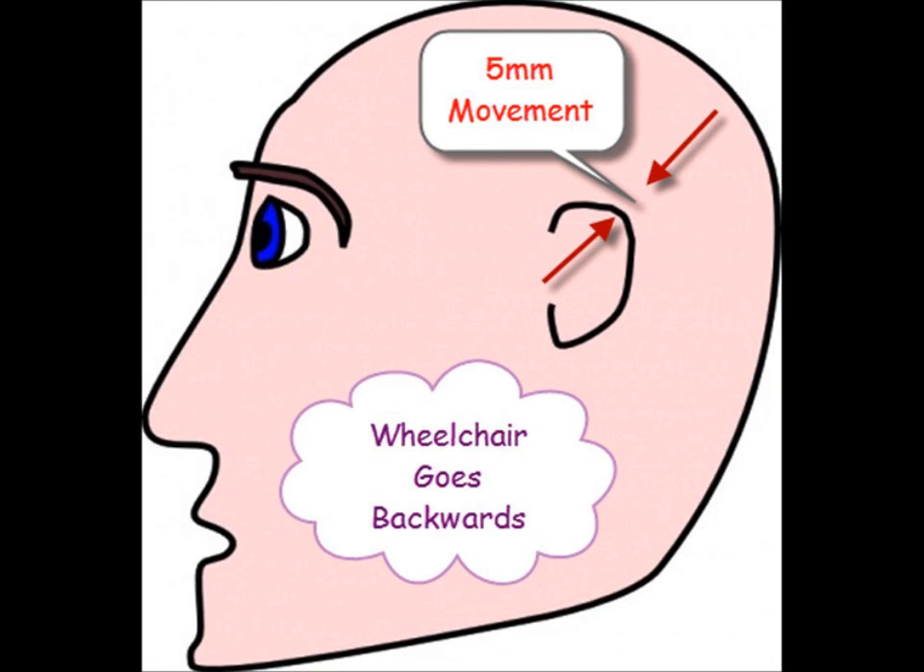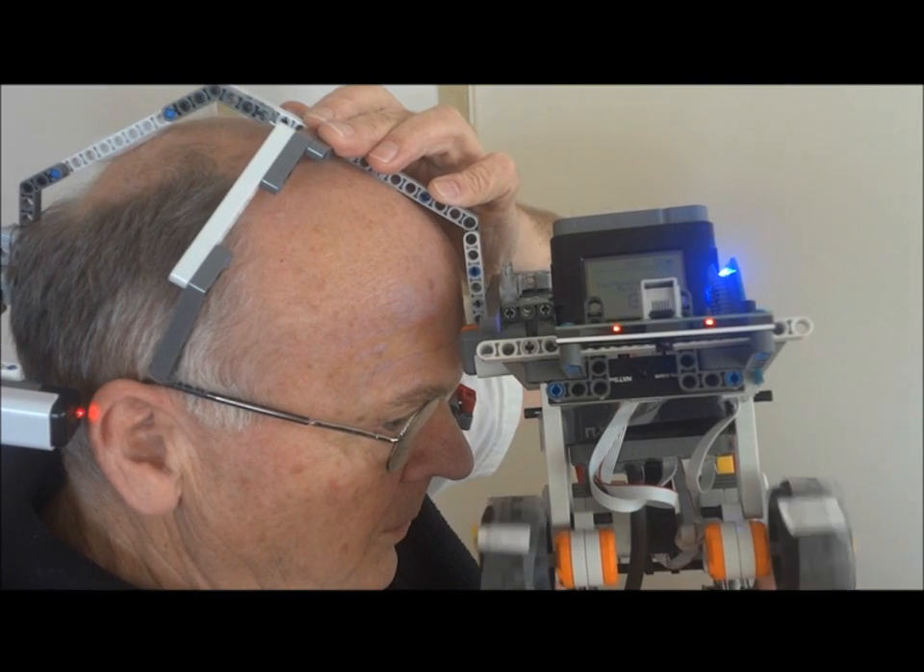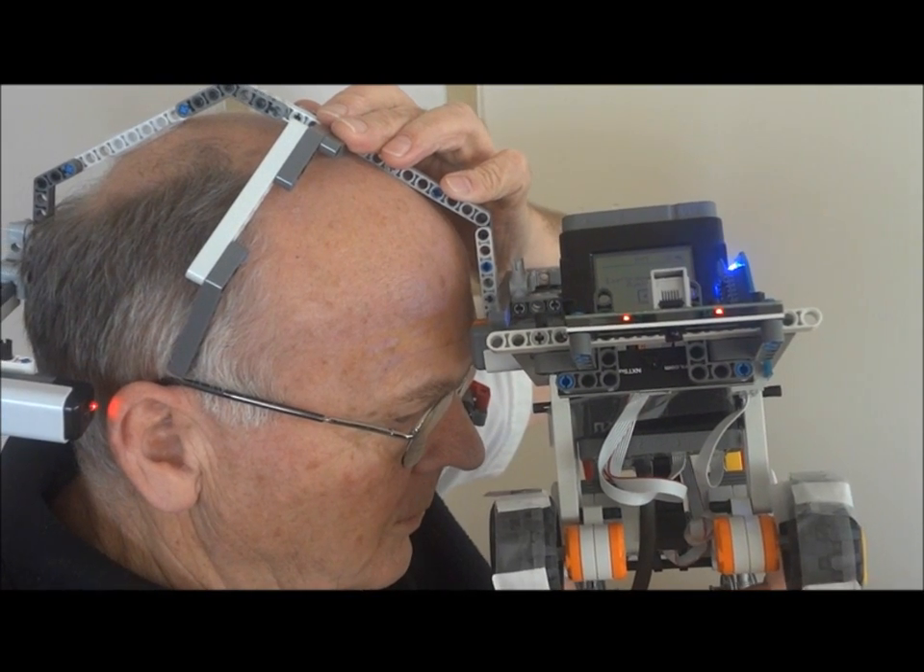We have about a 5 millimeter ear movement that the sensor can detect, and when the ear is back, my robot's program sends the chair backwards. With the ear in its normal position, the chair stops.